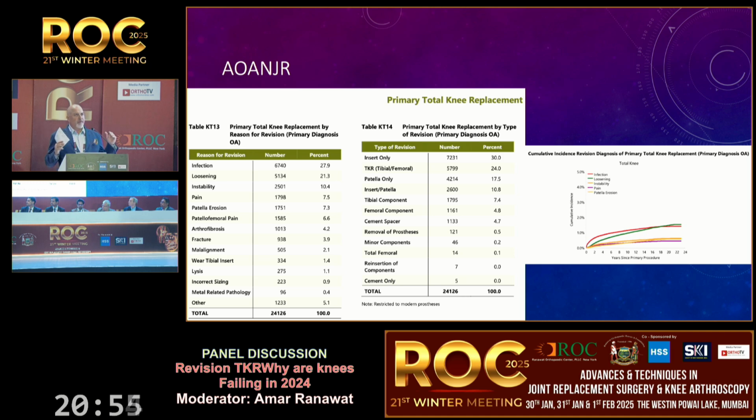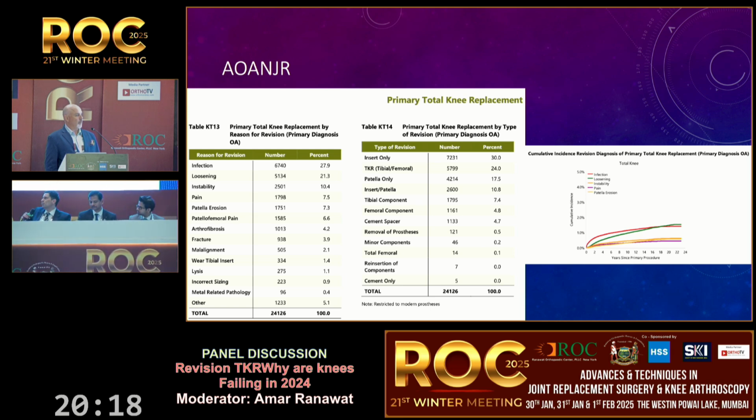So in the real world, infection is number one, loosening is number two. But what's in your practice the number one reason you have to reoperate? Periprosthetic fractures. Okay. Stiffness. Stiffness, excellent. Instability. Instability. Okay, that's your fault. Occasional patella problems if not replaced. Periprosthetic fractures, yeah. It is rarely patella, but I'll put infection at the topmost. It can come at any time, but we are reoperating only for... I don't dispute infection, but like I said, we'll talk about it later.